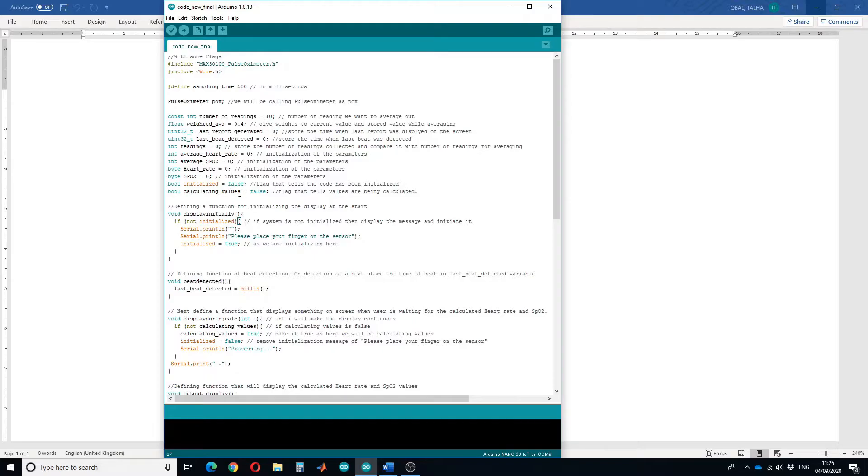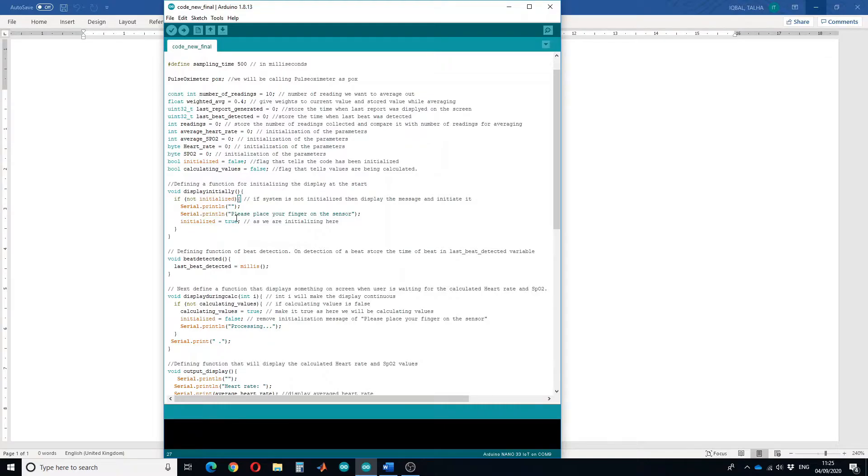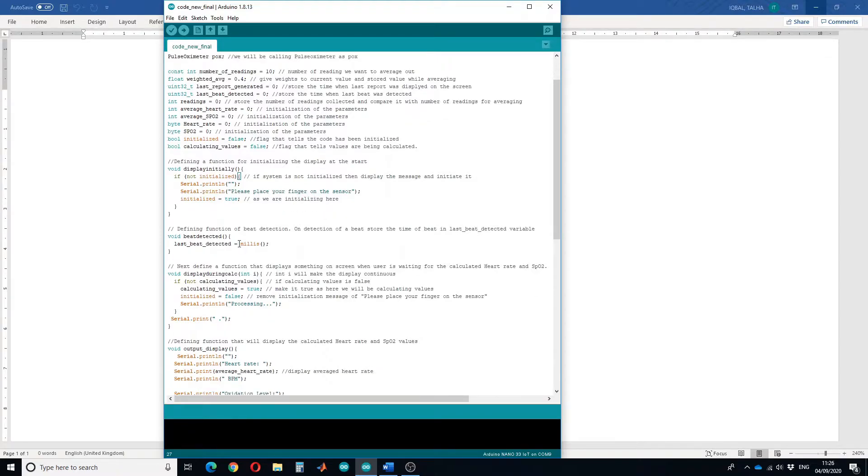I have defined some flags which will tell us about the code initialization. I have defined a few functions as well. This function is defined for initializing the display at the start, so it will print "please put your finger on the sensor." The second function is defined for the beat detection, so it will store the time when the beat was detected.